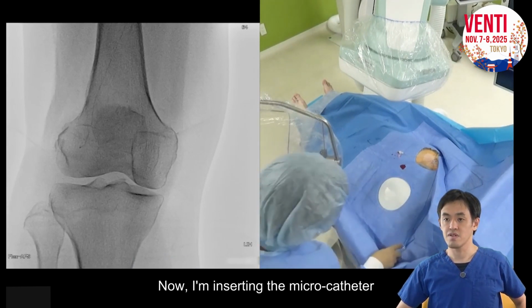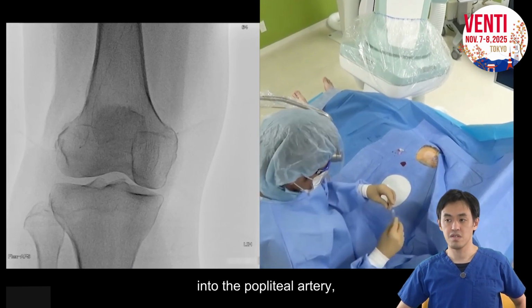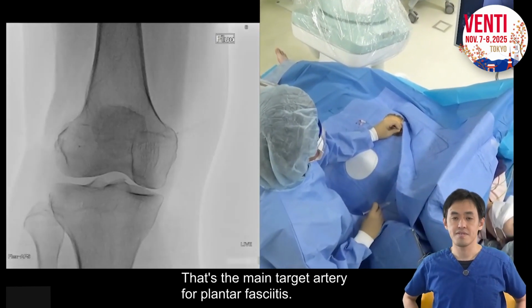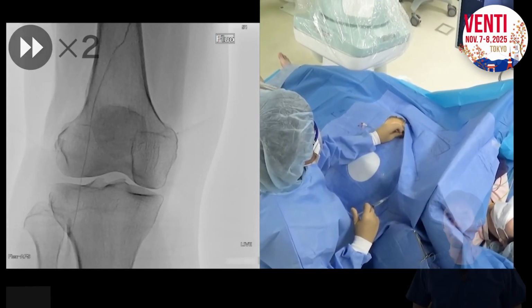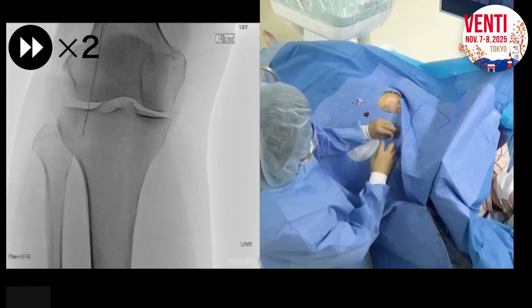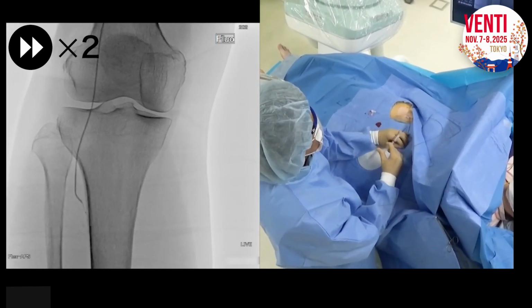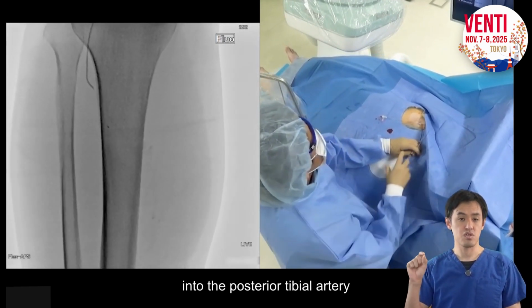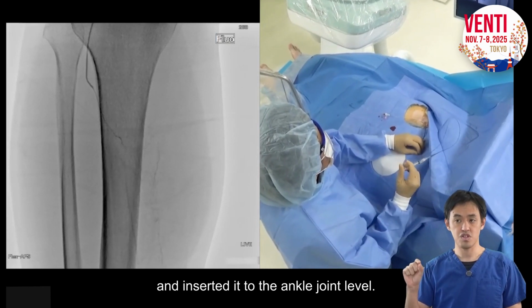Now I'm inserting the microcatheter into the popliteal artery and into the posterior tibial artery. That is the main target artery of plantar fasciitis. Now I'm inserting the microcatheter into the posterior tibial artery and advancing it to the ankle joint level.